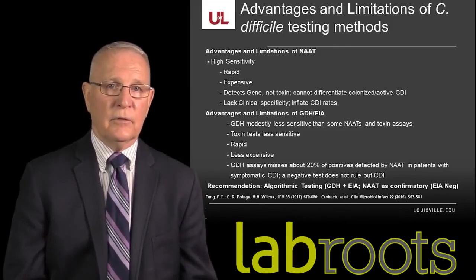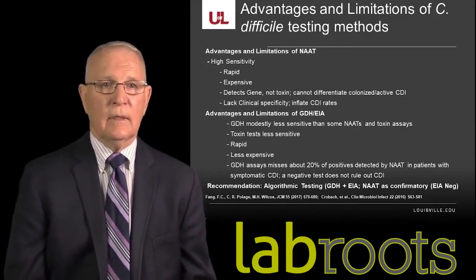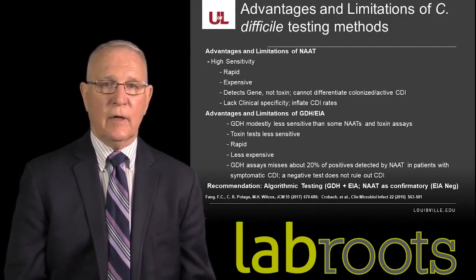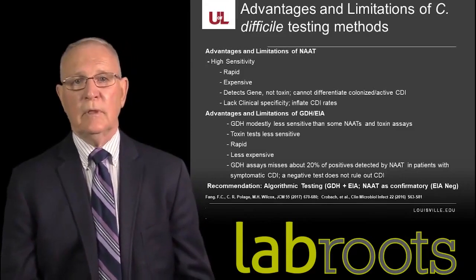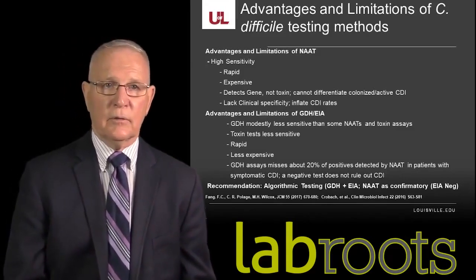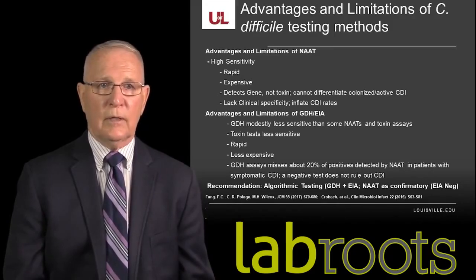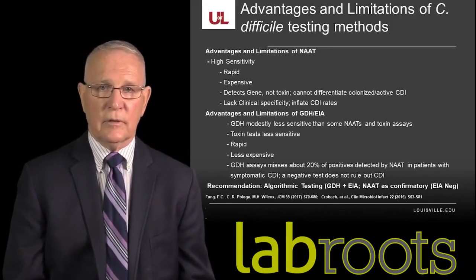We have noticed that by doing this we have reduced our overall rates of CDI, and to even further improve our testing and relationship to patient management, we created a checklist that the physician and or nurse must complete that lists criteria for eligibility of that stool specimen to be tested in the laboratory. And that checklist is sent to the laboratory and reviewed once again by the testing technologist, to ensure that it meets the eligibility for testing.